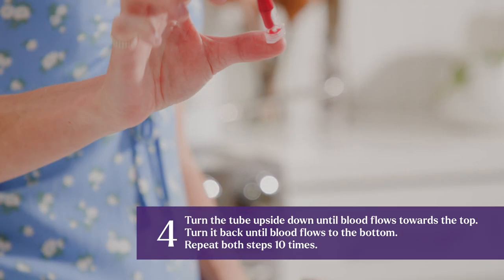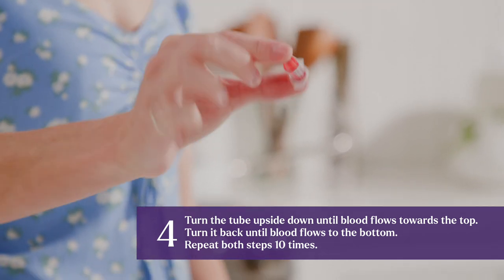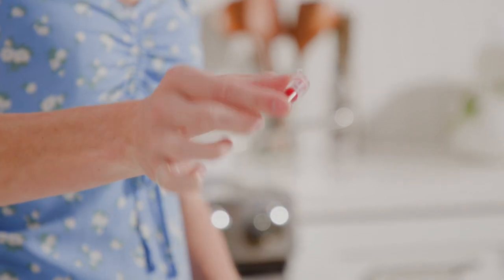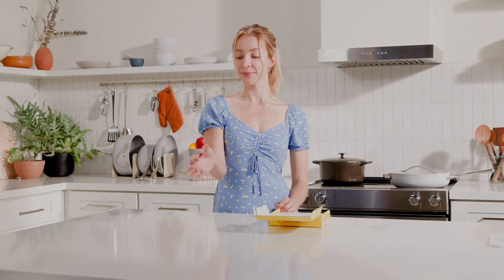Turn the tube upside down until blood flows towards the top, then turn it back until blood flows to the bottom. Repeat both steps ten times. This step mixes your blood sample with a preservative that keeps it in great condition during transit to our lab.